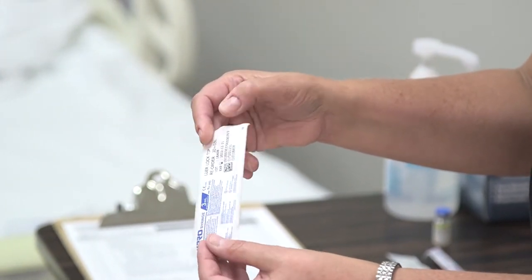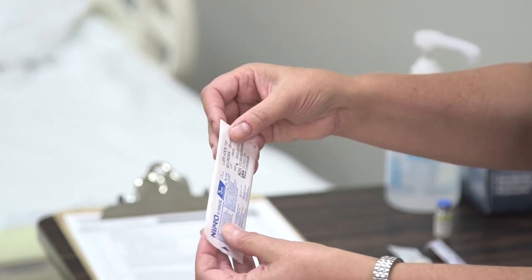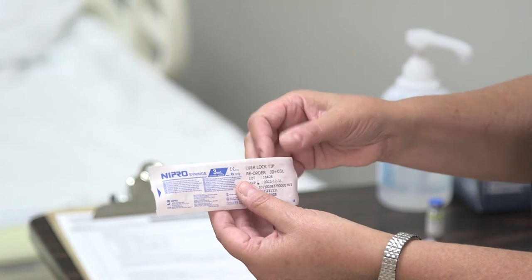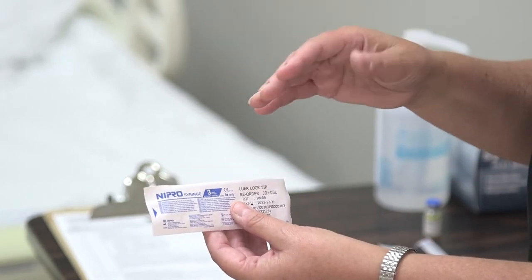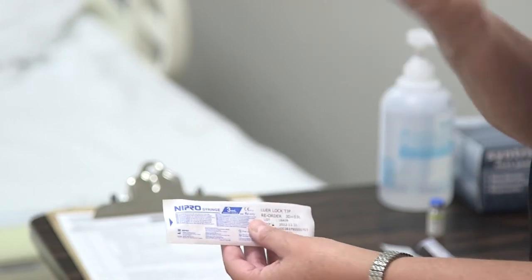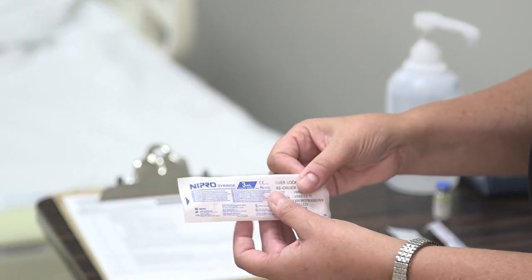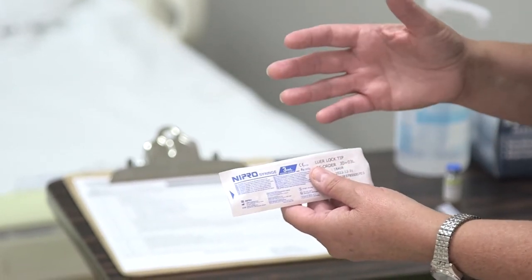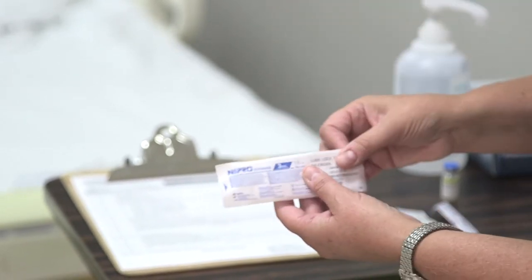This injection is going to go in the deltoid, so the length of my needle should be approximately a half an inch to 1 inch, depending on the person, if they're thin or if they have a lot of muscle or fat. We could even go with a 5/8 if we needed to go a little above a half an inch.